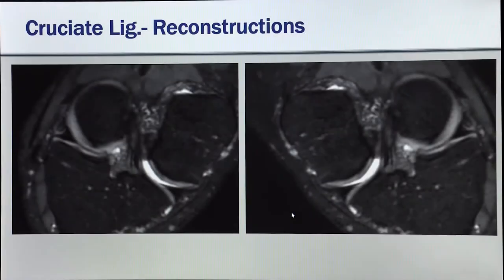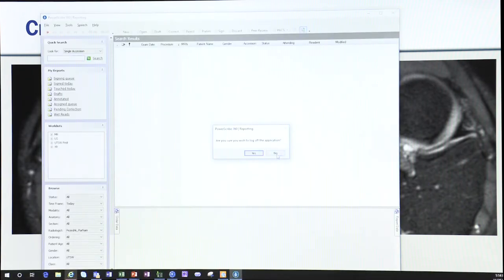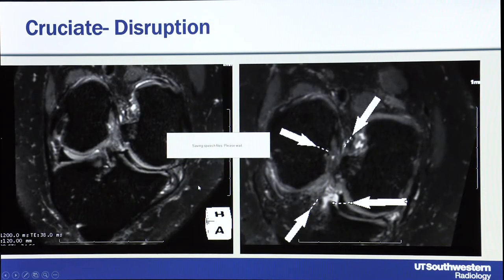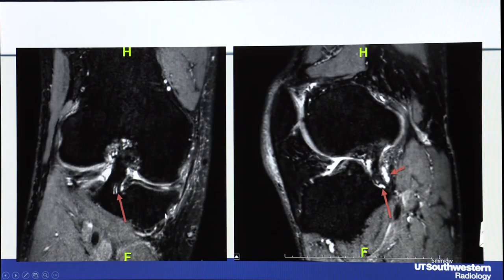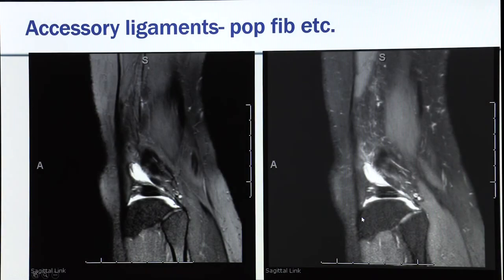Apart from the meniscus, you can do cruciate ligament reconstruction. The anteromedial bundle and posterolateral bundle join and unite at the femoral condyle attachment, visible in different planes. Here you can see the ACL — the mid portion is absent, meaning it's all torn. Similarly with the PCL, you can see small tears at the tibial attachment. These ligaments are beautifully seen on 3D images.